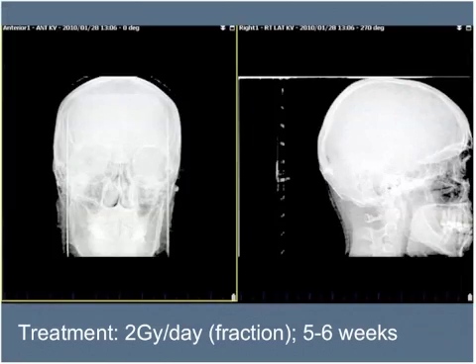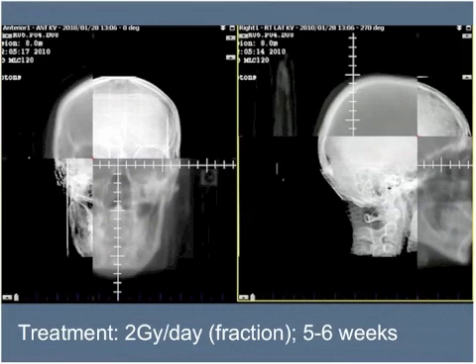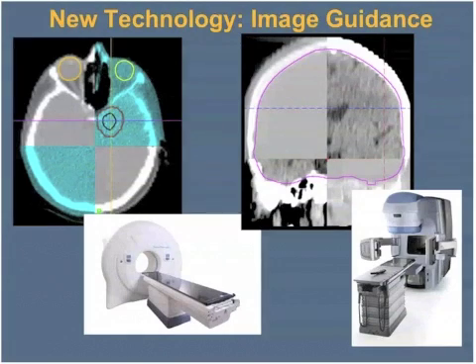In terms of the treatment itself, standard fractionated radiotherapy is given at a dose of 2 gray per day, what I would call a fraction, typically over 25 to 30 treatments. So typically 50 to 60 gray, 5,000 to 6,000 centigray. So again, we can acquire fluoroscopic-like images if we want, daily on the treatment unit. We can compare that to digitally reconstructed radiographs from our simulation, and we have overlay tools that allow us to show if these are lining up well and make adjustments on a day-to-day basis by looking at things like the correspondence between the bone tables. So just a simple 2D match using the AP and lateral radiographs can give us good accuracy in alignment day-to-day when combined with that mask-based immobilization.